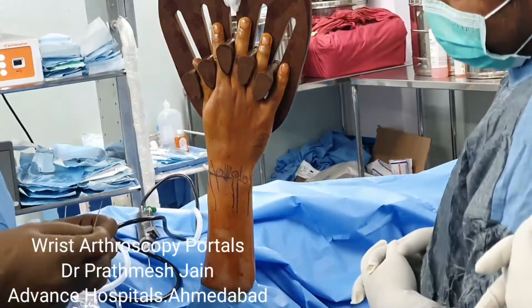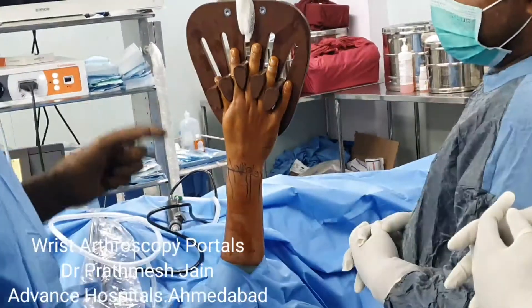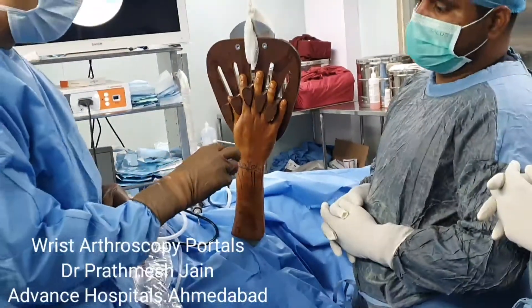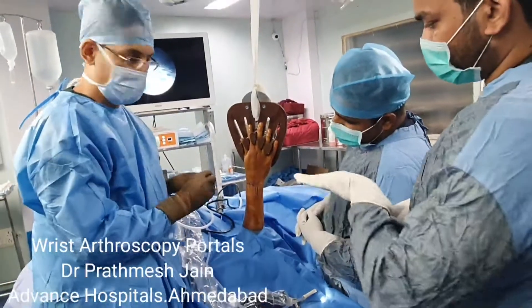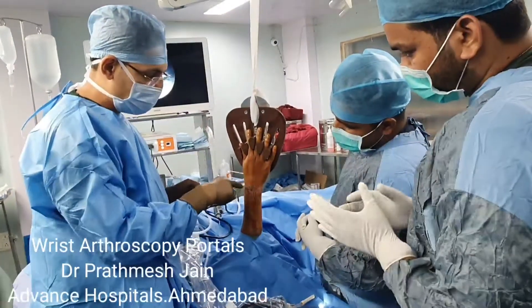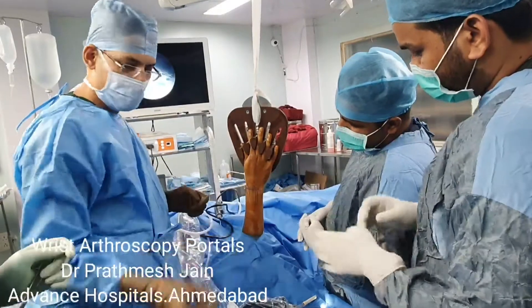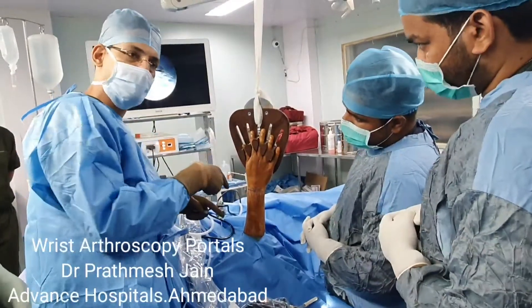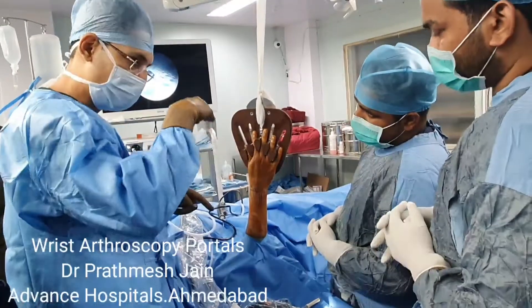We usually avoid making volar portals. The second important thing is you must be aware that a normal wrist joint has a volar angulation — it has an angulation like this. So whenever you are doing wrist scoping, you need to insert the needle and the scope in a 15 to 20 degree downward direction.